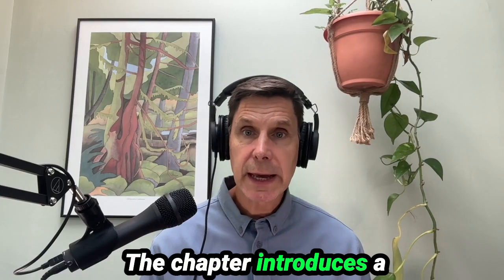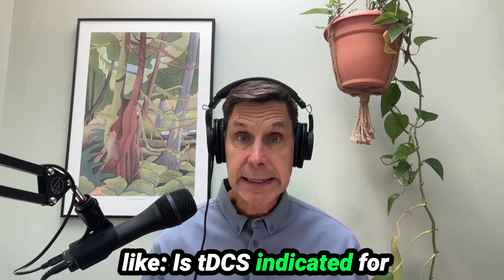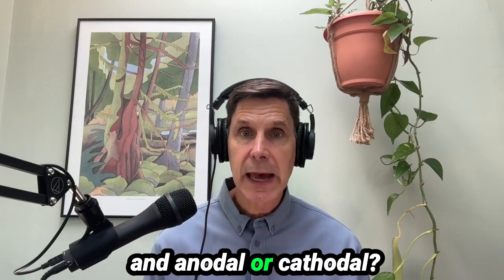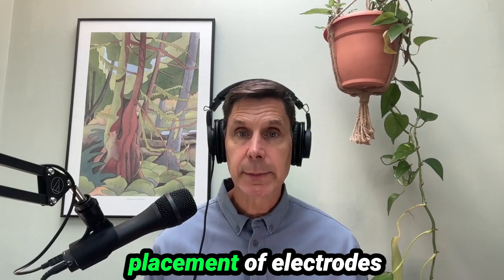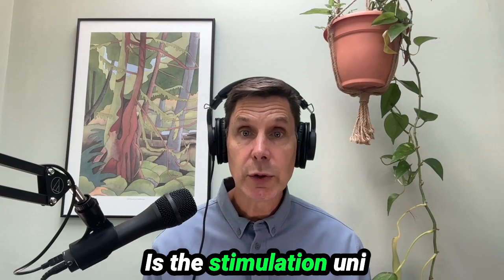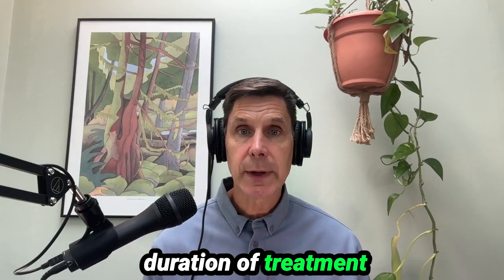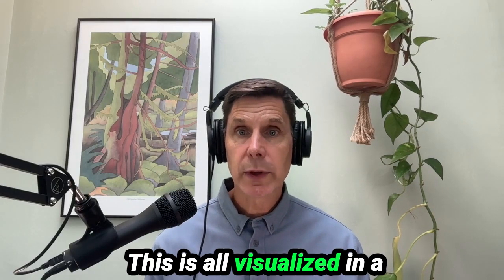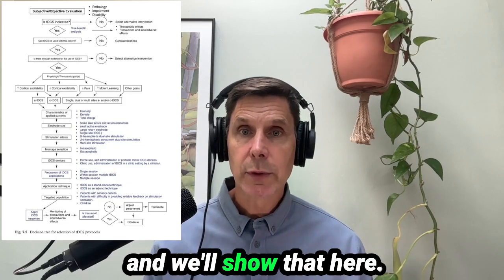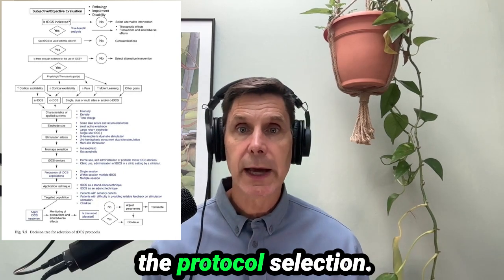So let's look at the tDCS decision matrix. The chapter introduces a decision-making framework that includes questions like, is tDCS indicated for this particular patient? What polarity should be used, an anodal or cathodal? What montage or placement of electrodes, and what electrode size is going to be optimal? Is the stimulation uni-site, bi-site, or multi-site? What frequency and duration of treatment is going to be best? This is all visualized in a clinical decision tree, which is figure 7.5 in the textbook, and we'll show that here. And this guides the clinician from the clinical question through to the protocol selection.